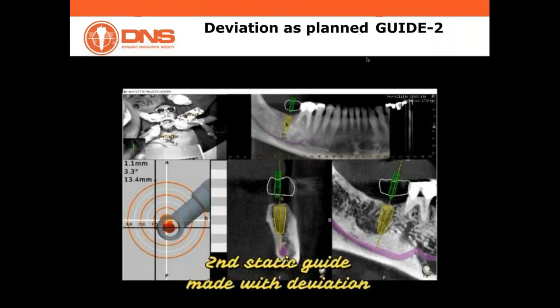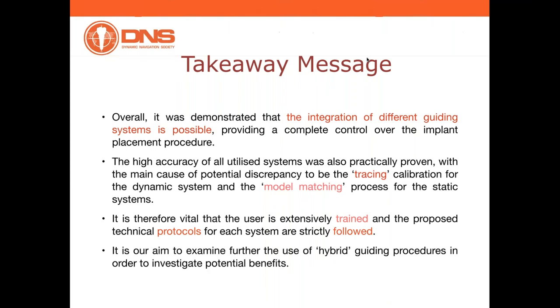They use freehand after that, using only Navident. And after pilot drilling is done, I get this result. The result shows that we were accurate. Further on, the use of hybrid guiding procedures to investigate potential benefits. We are already doing this as a second study. I thank you very much from Greece.